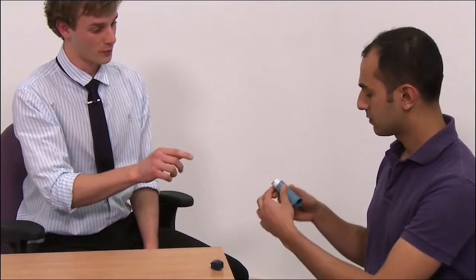So the first thing to do is sit up nice and straight, take the cap off the inhaler, and just check that the mouthpiece is clean. Give it a little shake, and then make sure that you're holding the inhaler with your thumb at the base and a finger on top.